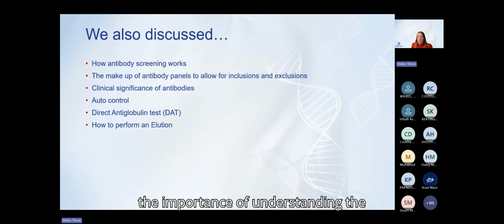We discussed the importance of understanding the clinical significance of antibodies, because sometimes you may have low incidence antibodies that, while it could be a bit of a nuisance, they're not actually clinically significant and they're not going to cause your patient any harm. So you don't need to actively exclude those as part of your investigation.